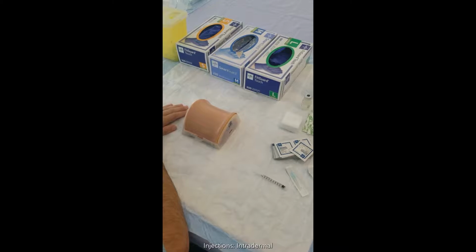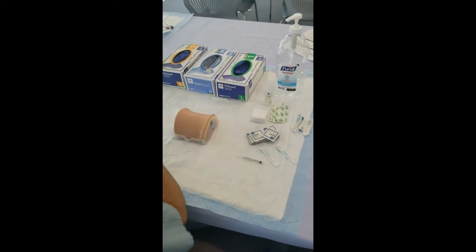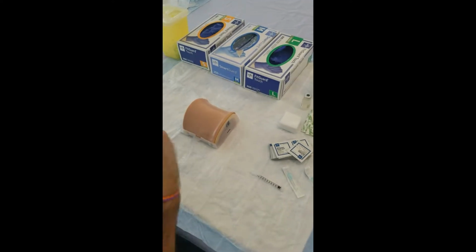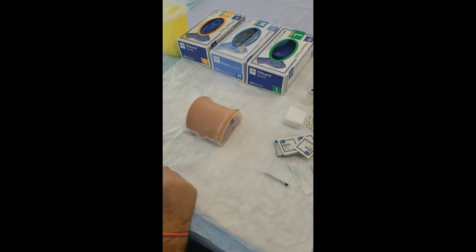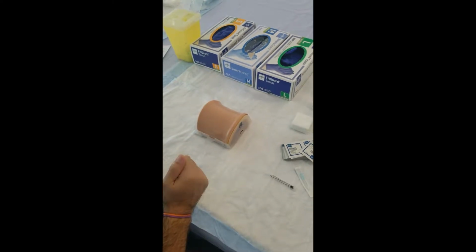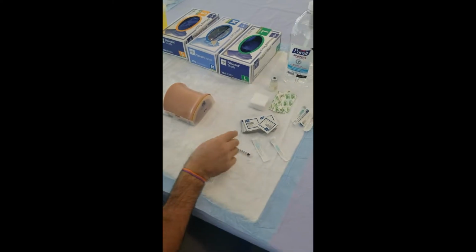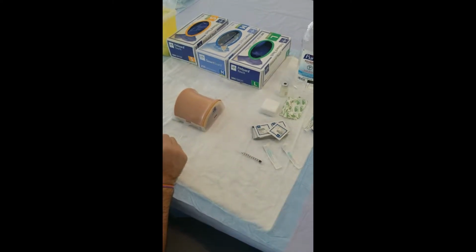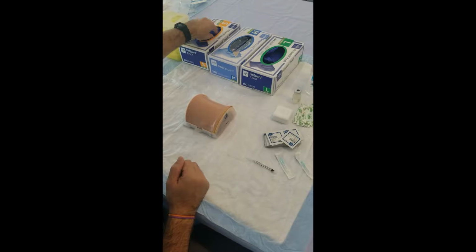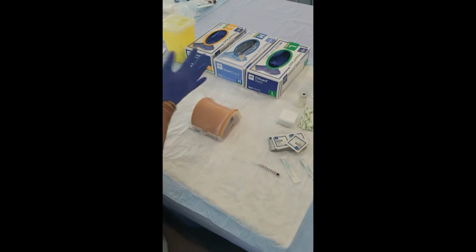Injections. Intradermal. Step 1, washed hands. Step 2, identified patient using at least 2 identifiers. Items 3 through 5 can be done in any order. Step 3, prepared all equipment. Step 4, put on gloves. If student completed any of the other injection types and was wearing gloves, they may continue wearing the original pair.